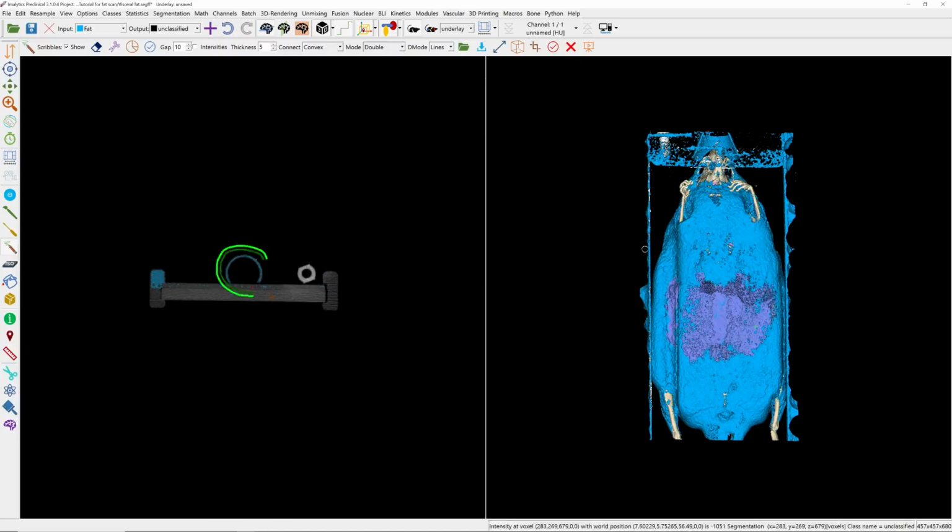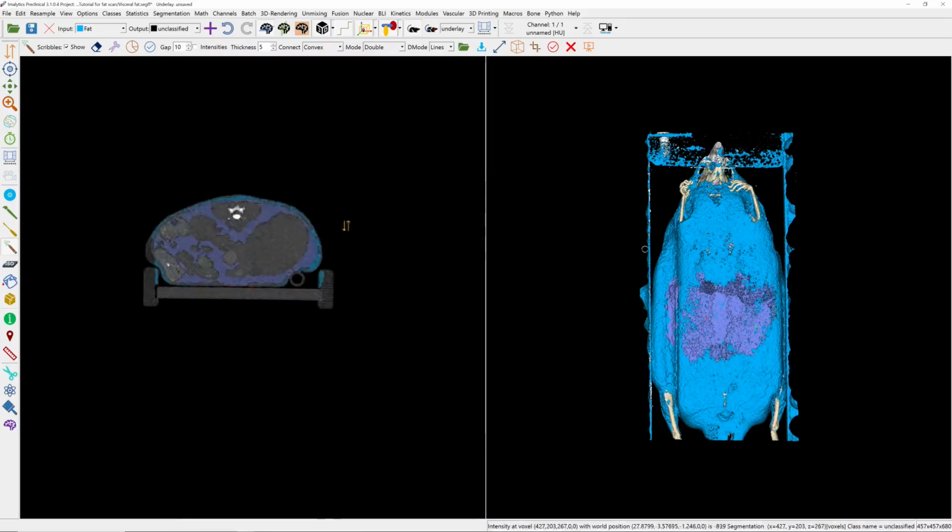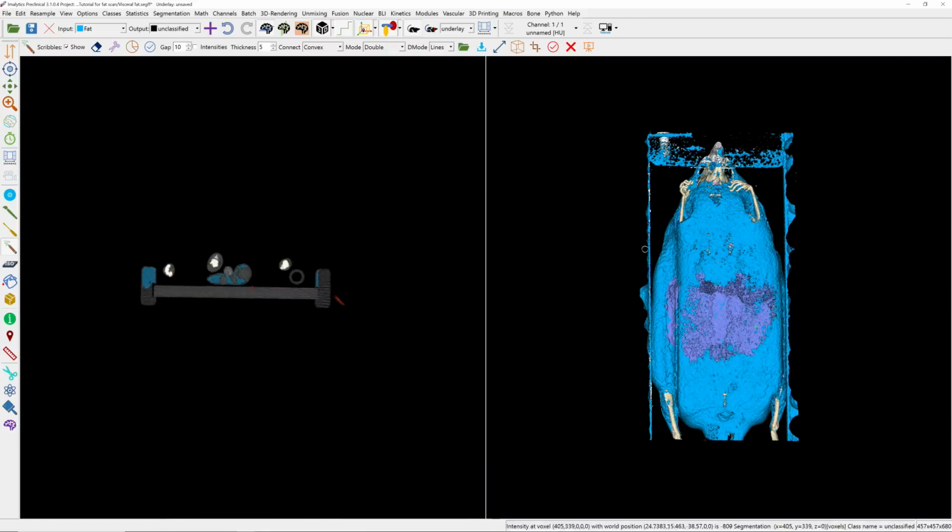So again, here, here, scissor, worked. Okay, then we do that also for the sides of the mouse pad. So one end and go to the other end. Okay, use the scissor. Now you can see that part was removed. And we do the same for the other side.